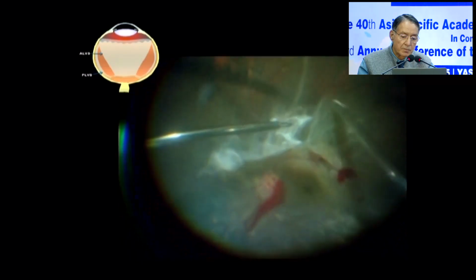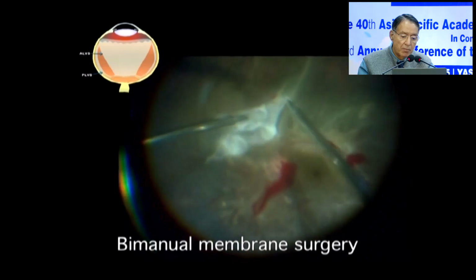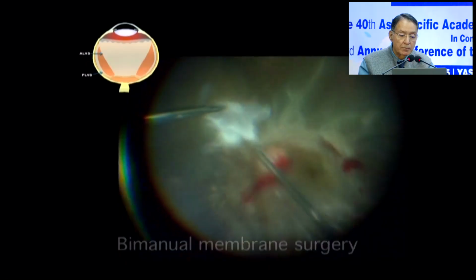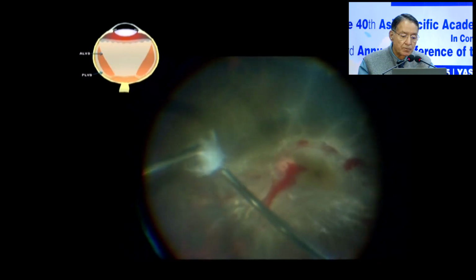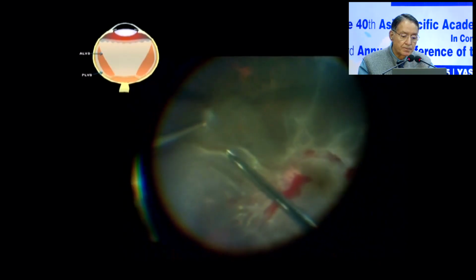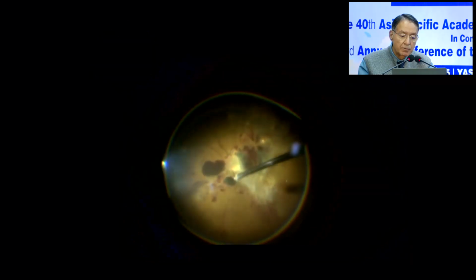We generally prefer outside-in delamination, especially for the superior and lateral parts of the membrane, as this gives a better view of the connections between the membrane and retina, and consequently less bleeding and iatrogenic breaks. However, one needs to be flexible to do the best in a given situation. Apparently simpler looking cases can be extremely tricky and tough.